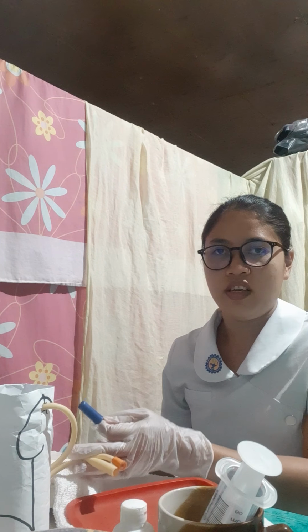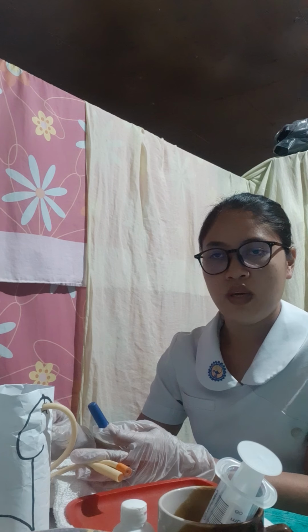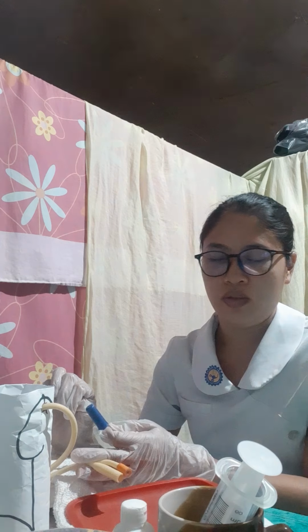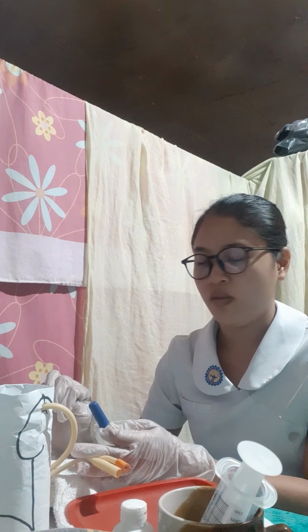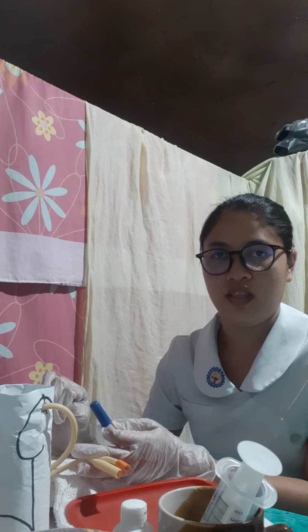Make sure not to touch the edge of the bed or the basin, because it is considered contaminated if it touches.